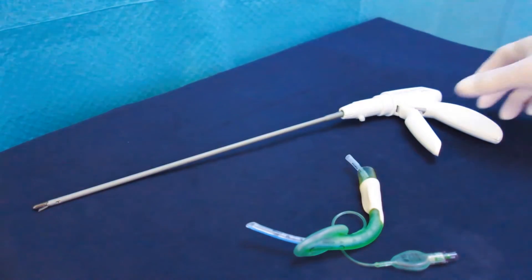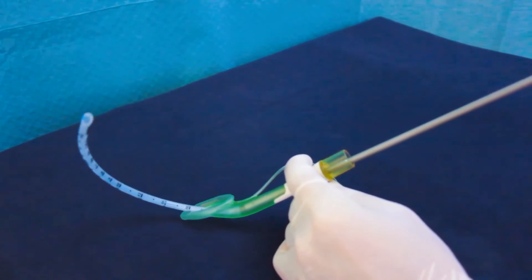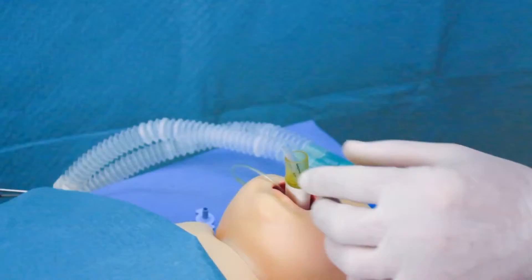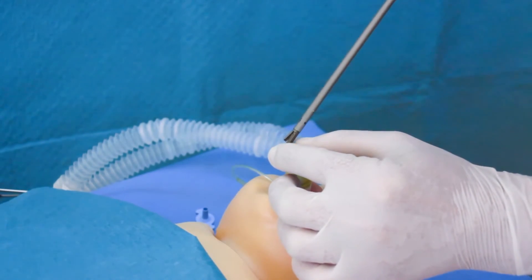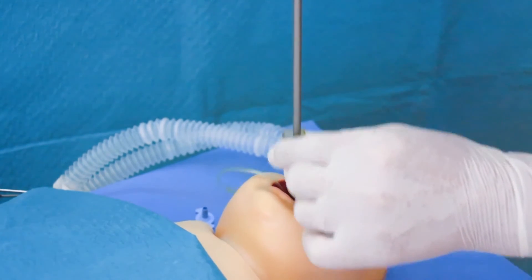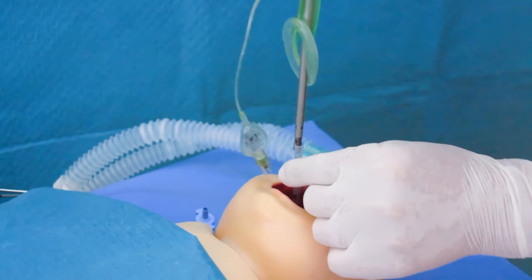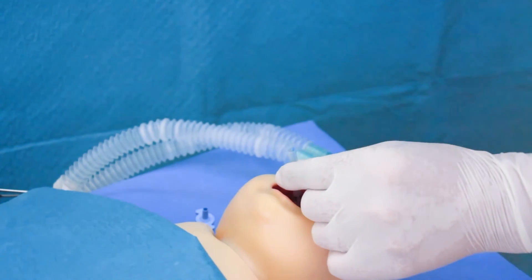An alternative technique uses a thin, long forceps as used by ENT surgeons or endoscopic surgeons. Fix the proximal end of the tube with the forceps, push the tube slightly deeper into the trachea and pull the laryngeal mask upon the forceps. The forceps will stabilize the tube and prevent it from dislodging.